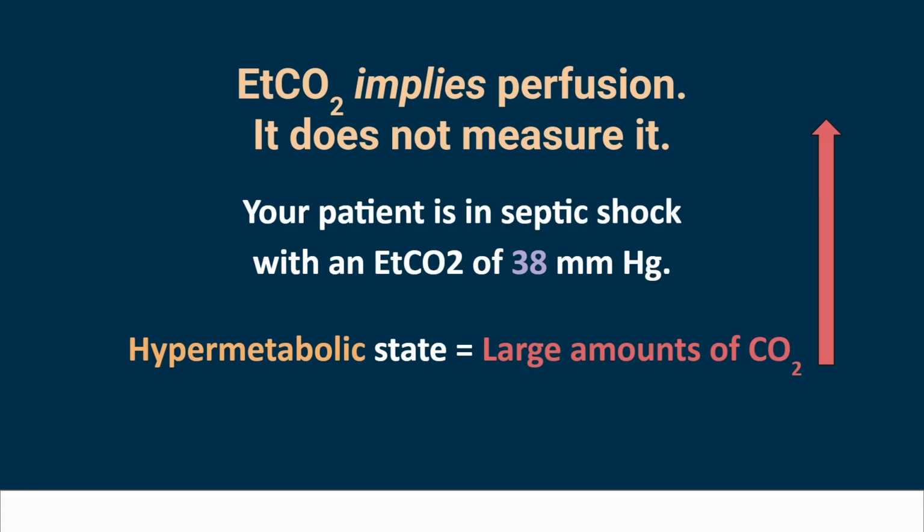Why isn't it, in a guy in septic shock? Oh, you beat me right to it. Let me finish it just in case. Why would a guy who is hypermetabolic, creating large amounts of CO2, in septic shock still be hypoperfusing? Because he had already had a super high end tidal and he's on his way down? Okay, I can appreciate that. There's a simpler answer, but I like where you went with that. Aiden? Further along in the timeline, which was kind of what he was saying. Alex?